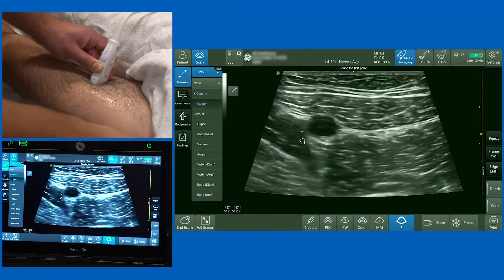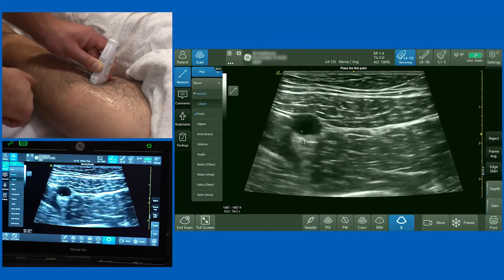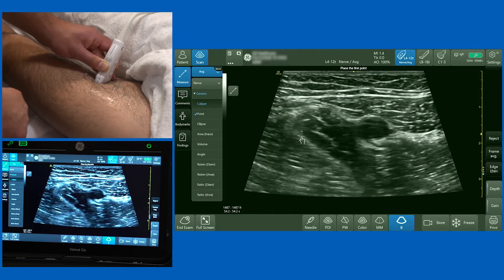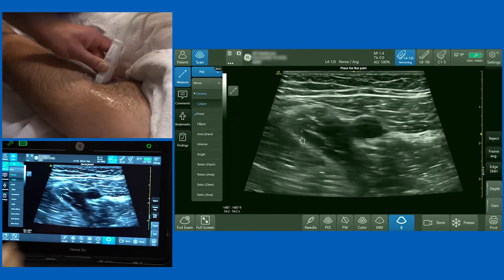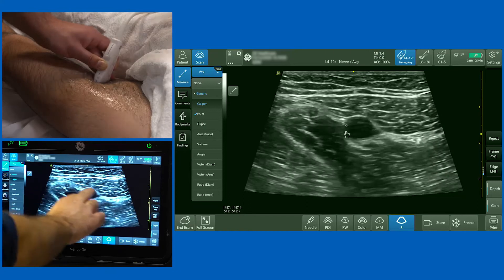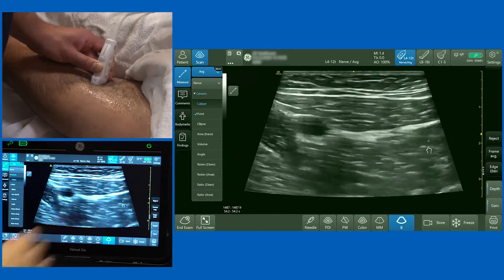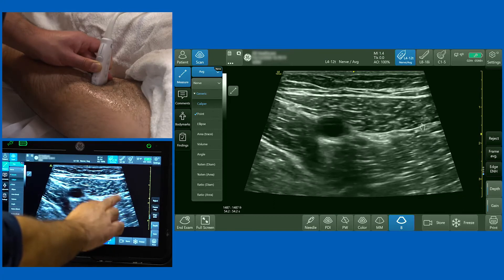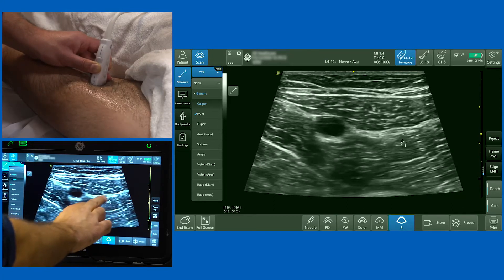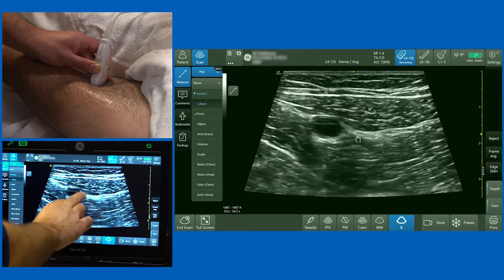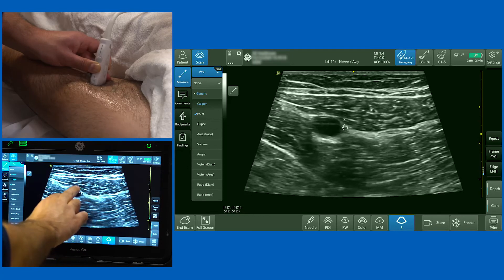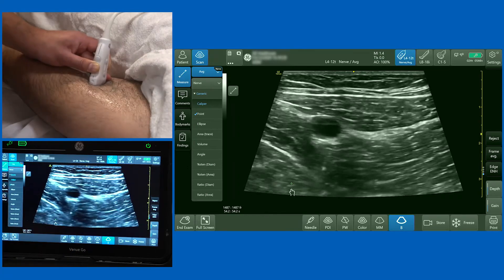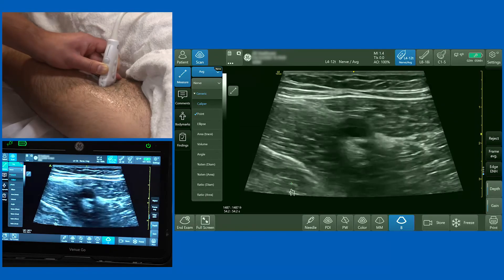In summary: place the probe in the middle of the thigh, make sure you're at the point where the medial border of sartorius meets the medial border of adductor longus, and inject your local anaesthetic through the groove between sartorius and vastus medialis, aiming to open up this space and get the lateral structures sitting within that tunnel — which are the saphenous nerve and the nerve to vastus medialis.